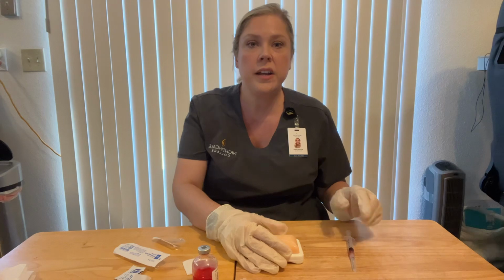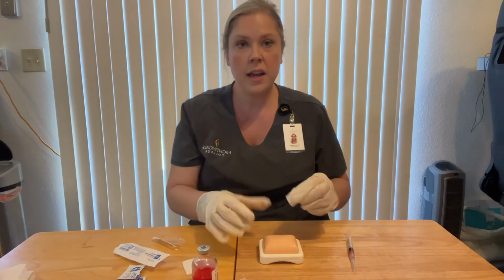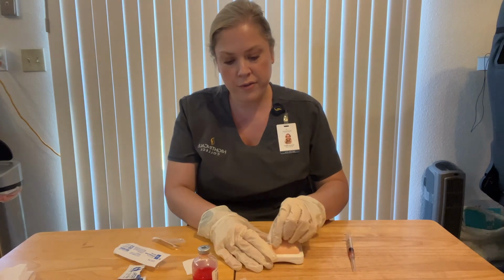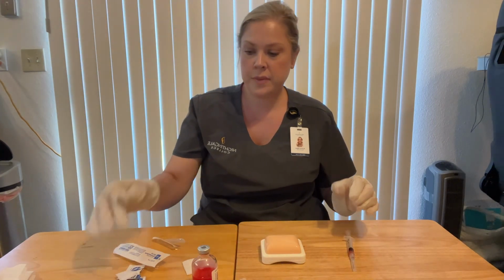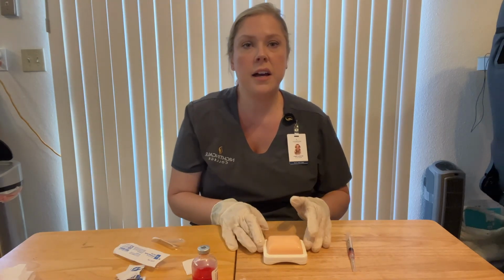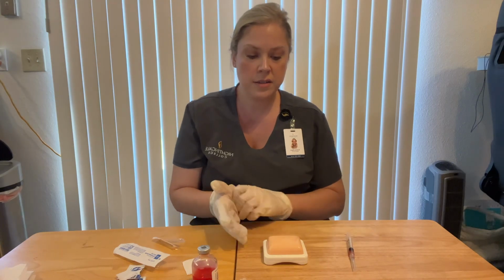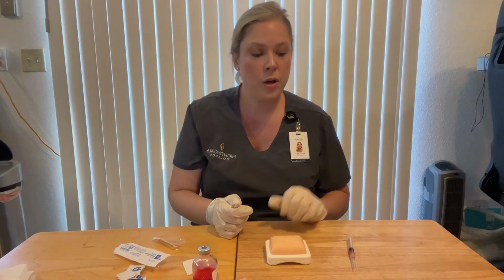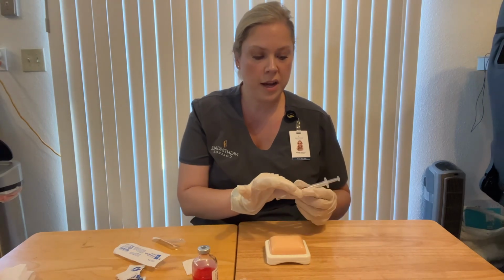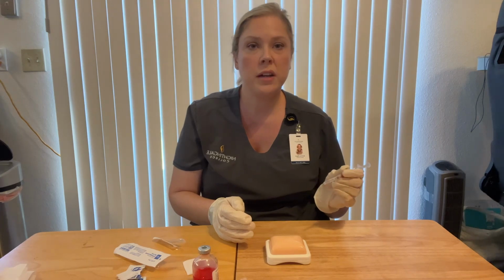Okay, perfect. Then I'd want to take an alcohol wipe and clean the injection site inside to outside about 5 centimeters. We want to let the site air dry and not blow on it or fan it dry with our hands. And then I'd want to hold the syringe with my dominant hand between my thumb and my forefinger, kind of like I'm holding a dart.